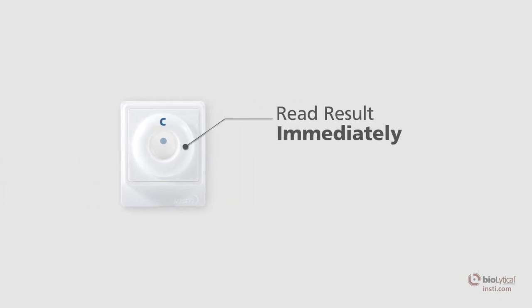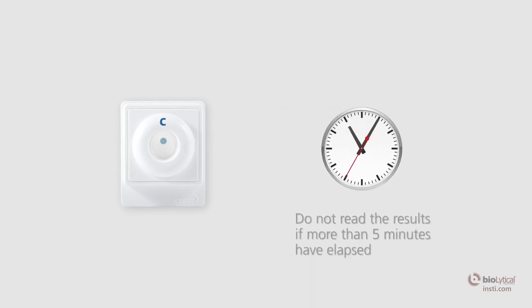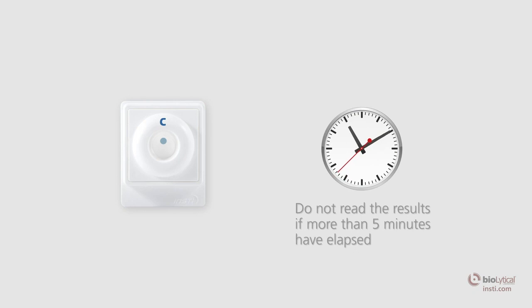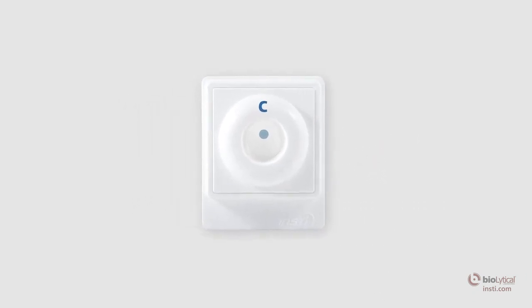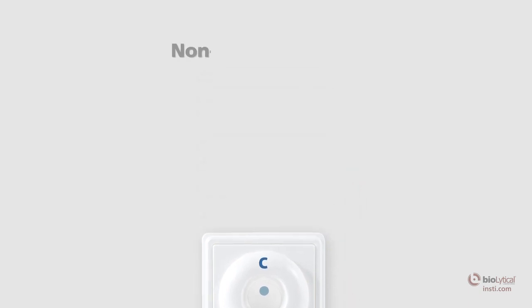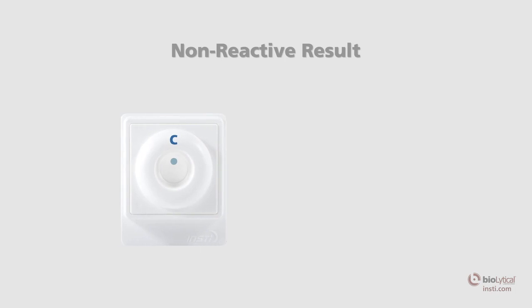Immediately read the result while the membrane is still wet. Do not read the results if more than five minutes have elapsed following the addition of clarifying solution. When reading the results, make sure the tab of the membrane unit is oriented towards you. A non-reactive result shows one blue control spot that is clearly discernible above any background tint, indicating the test has been performed correctly and a human specimen has been used.